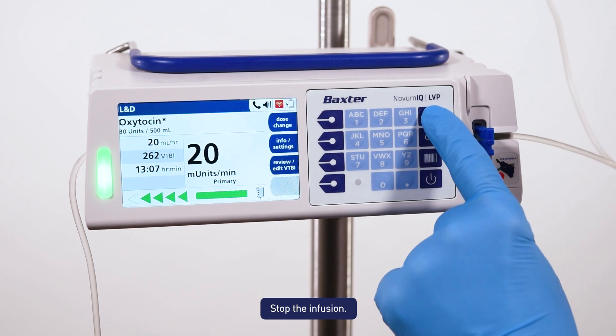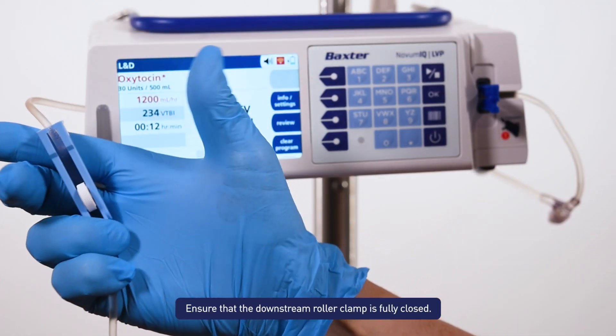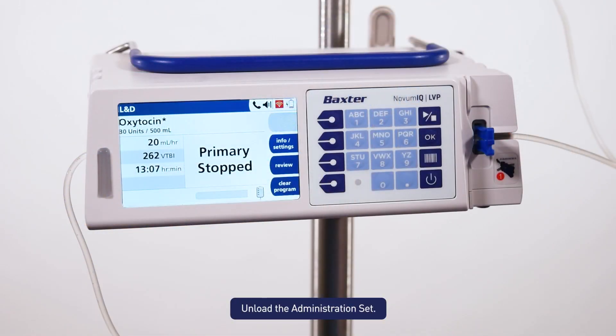Stop the infusion. Ensure that the downstream roller clamp is fully closed. Unload the administration set.